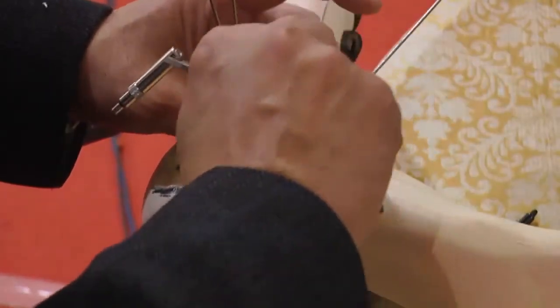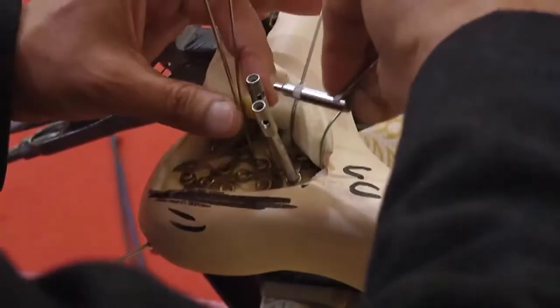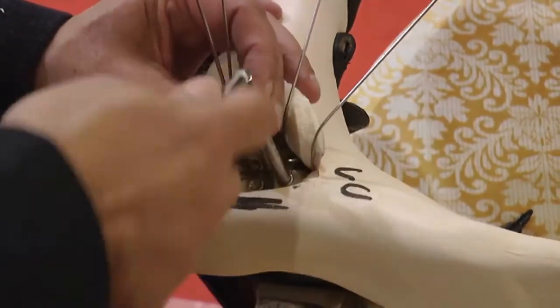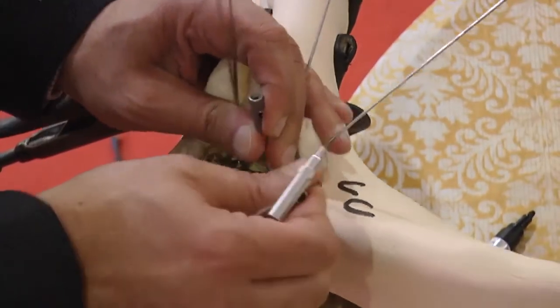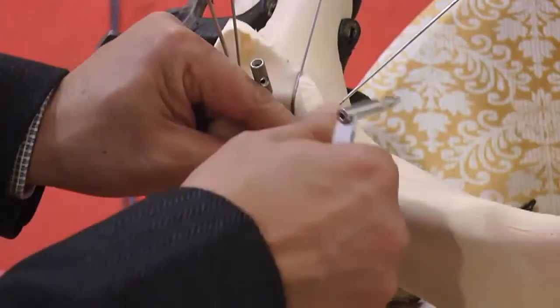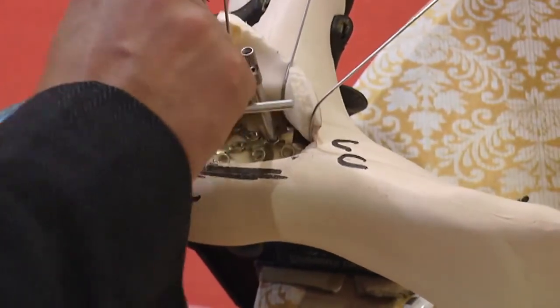You can tighten the locking towers with a mosquito. With a mosquito, tighten them fully, and you can use these towers as benders of the plate. So it is possible now. If I do this, you see the plate has gone down here. So this plate is fairly malleable, and each part can be individually bent, changing the locations of the locking towers wherever you want to bend them.